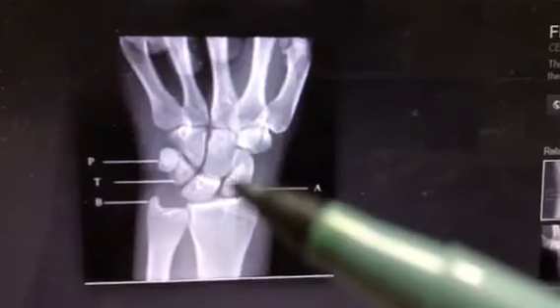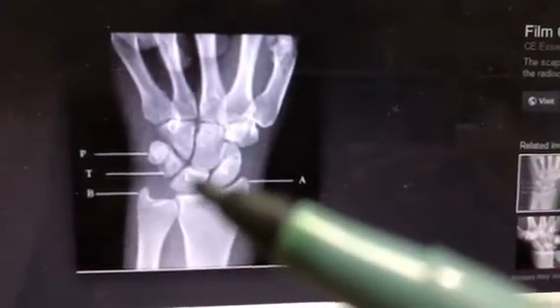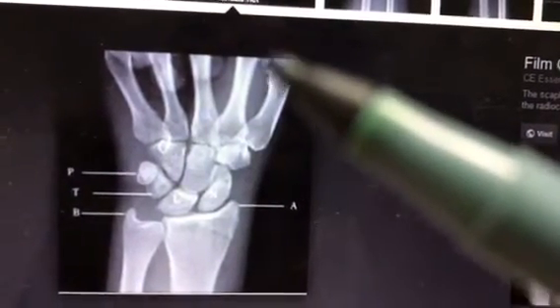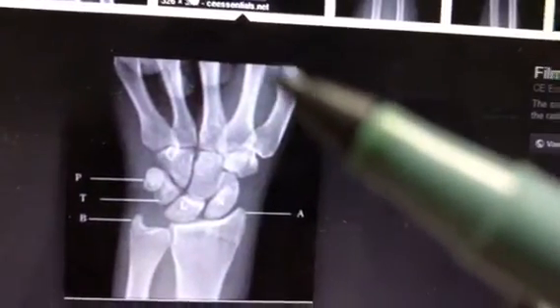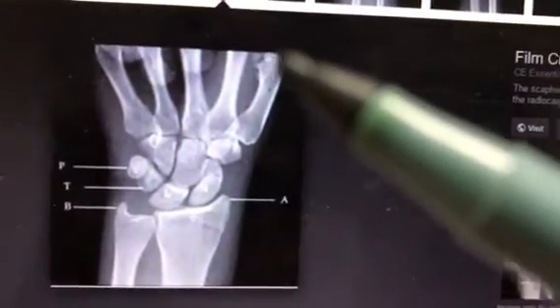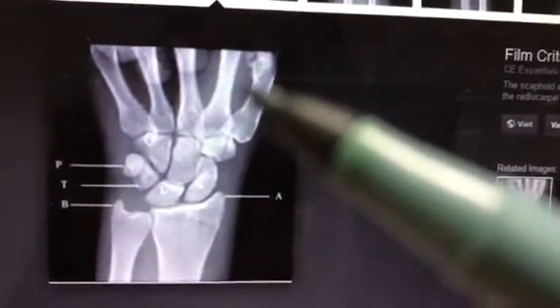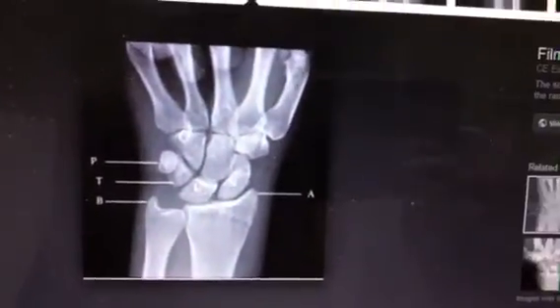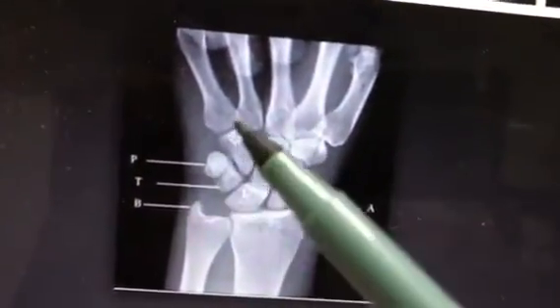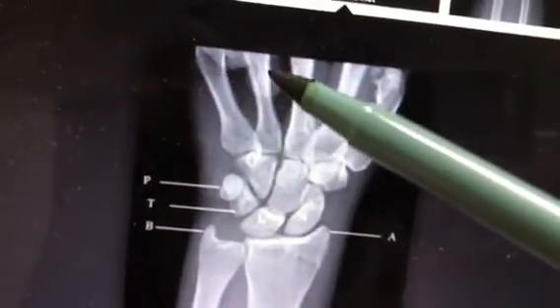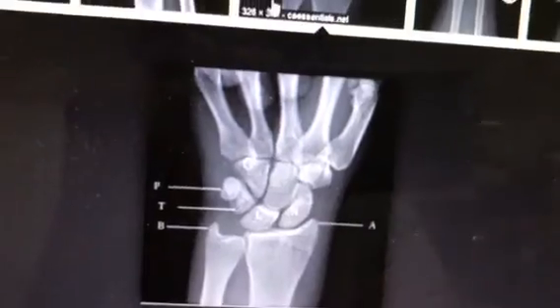Scaphoid is prone for avascular necrosis, while lunate is prone for dislocation. At the thumb, you can see the first metacarpal and a small prominence — this is also a sesamoid bone, present inside the tendon of flexor pollicis brevis. The long bones visible are the metacarpals; the proximal end is the base of the metacarpal and the distal end is the head of the metacarpal. This concludes the wrist joint review.